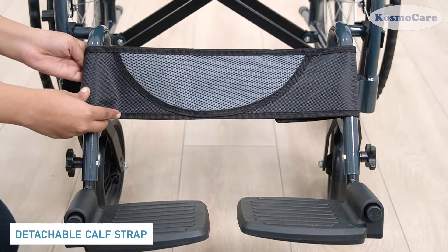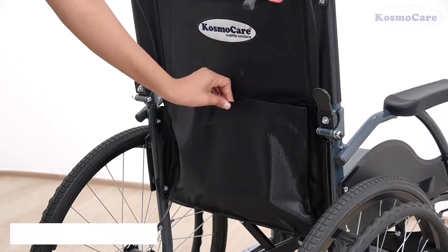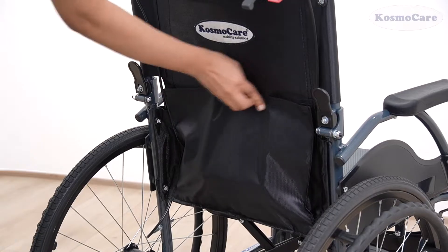The footrest comes equipped with a detachable calf strap to support the legs. Store your essentials in the back storage pocket provided, while keeping your hands free.